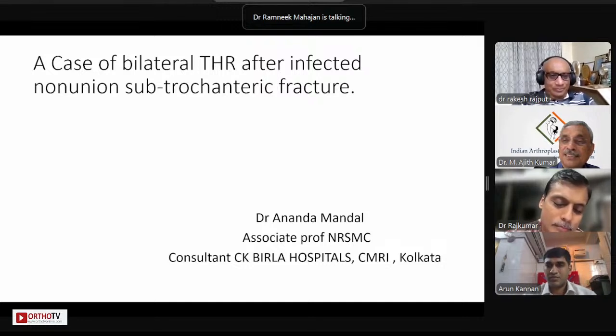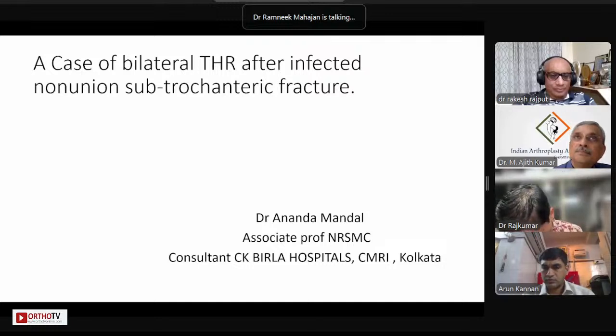What I have realized in these kinds of cases, stiff knees and ankylosed knees, is that the moment you take off the patella and thin it out, you have a lot of space going up. It's more of adhesions and tearing the gutters.